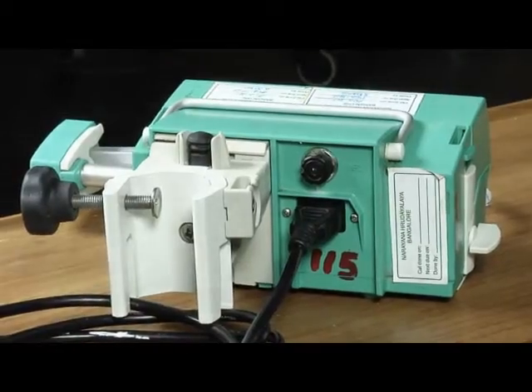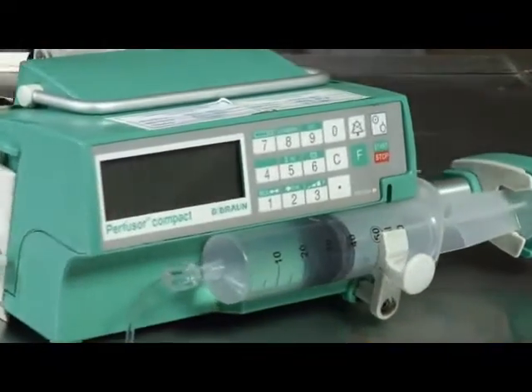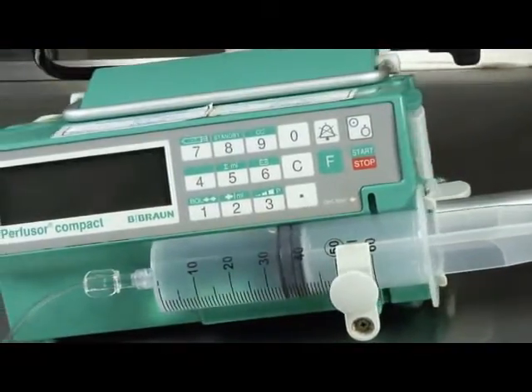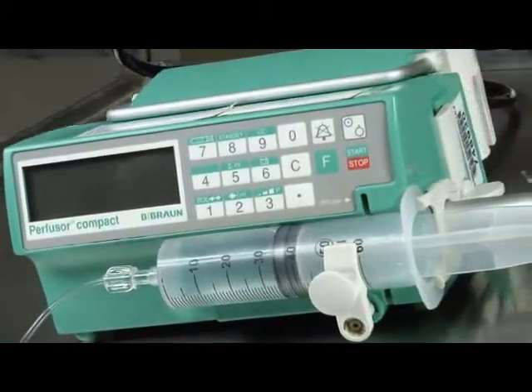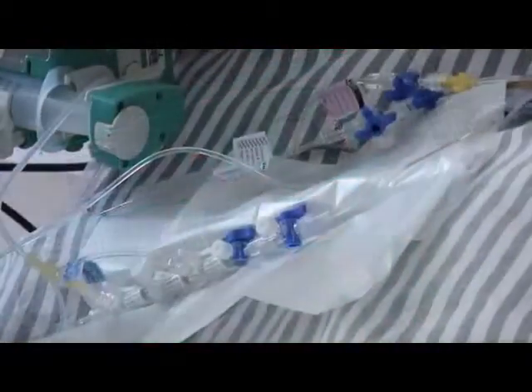For this demonstration we will be using a B-Braun model of syringe pump. However, various manufacturers and models are available in the market. The overall functions are similar, but the specific appearance and functions may differ slightly.